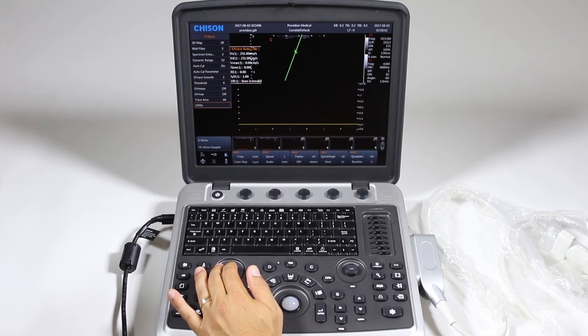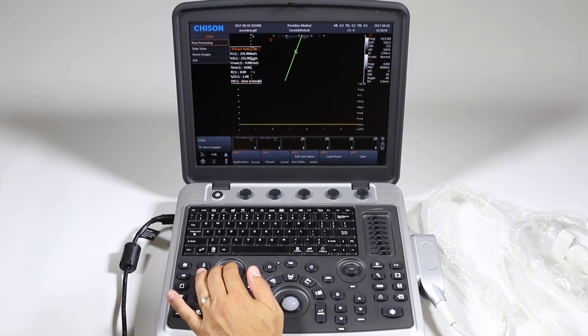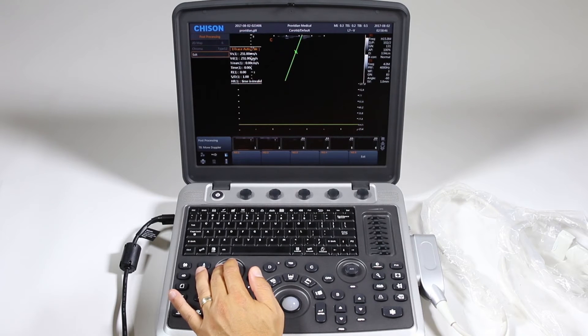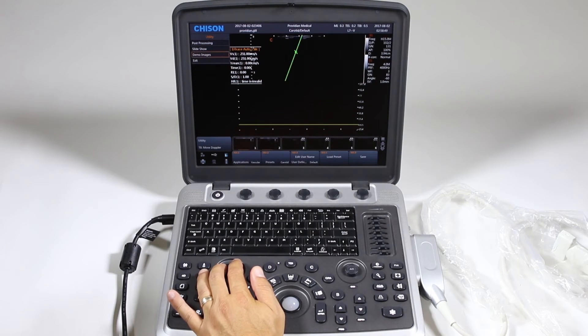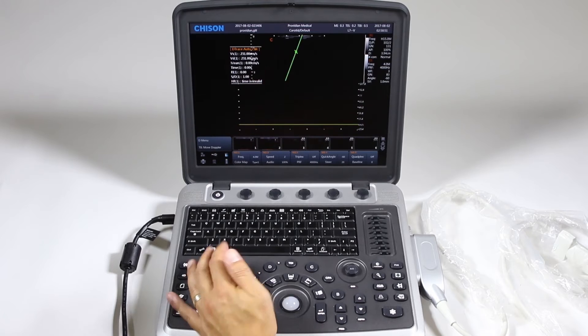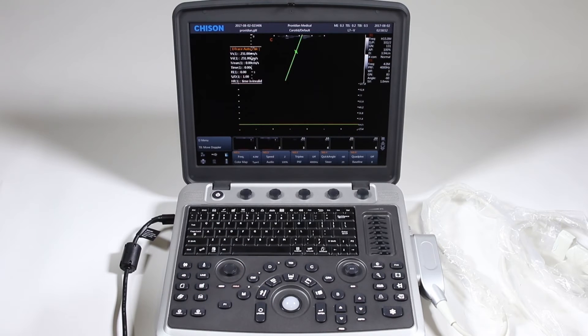For utility you can click down on that. Under post-processing there's nothing you can change here, that's all for the 2D. Go ahead and click exit and get out of that imaging.